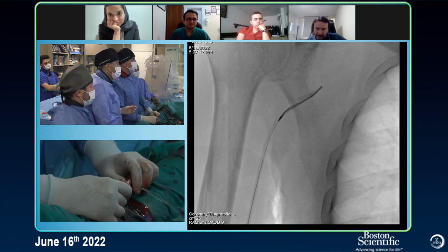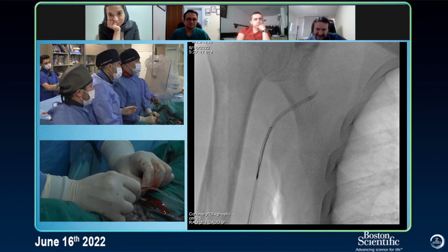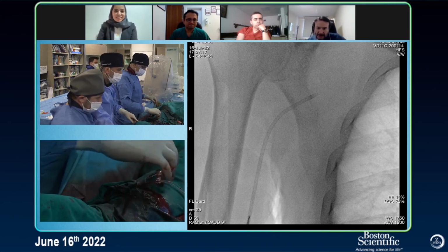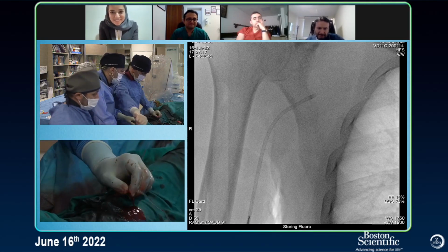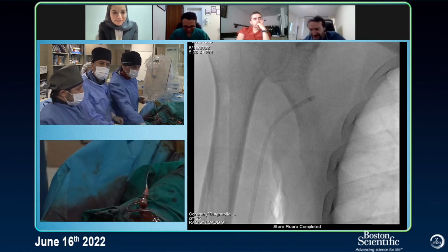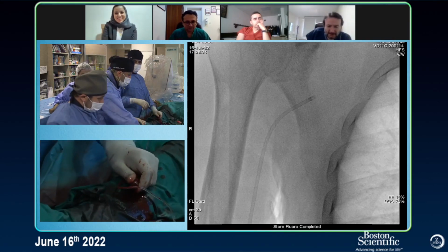Maybe I will catch it from the other side. Yes, now I did it. Okay, I think I could. Okay, big applause. Guide it. Excellent. You got it. It is here. We catch it. All right, let's go. Start the game again.